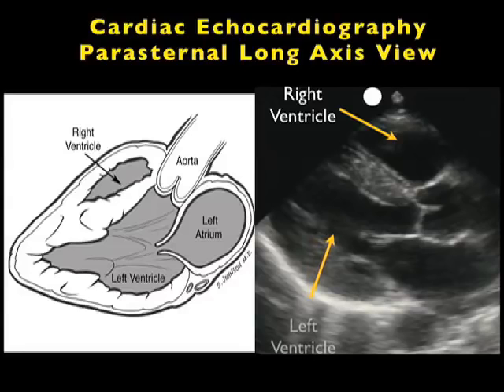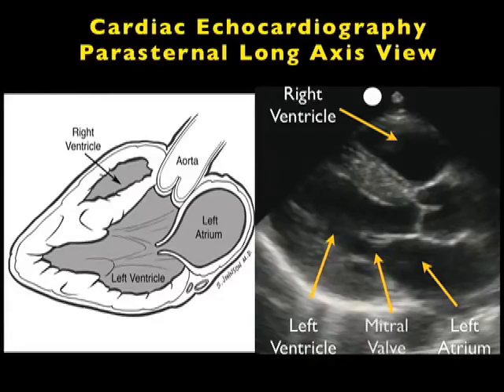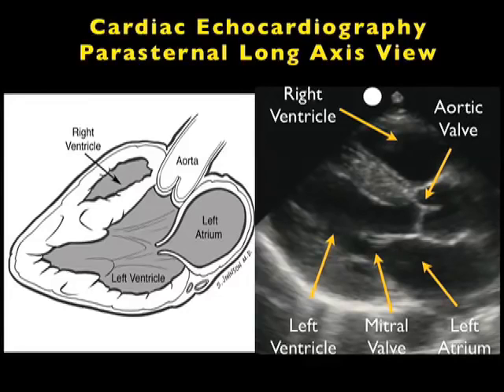Let's look at the ultrasound still image here to the right. Again we see the superficial right ventricle. Posterior we see the left ventricle with its more muscular and hypertrophic walls. Notice the left atrium is seen to the right of the left ventricle and the mitral valve in between the two chambers — we categorize this as left ventricular inflow tract. Note the aortic valve sitting right above the left atrium, and we see a little bit of the aortic root there. This is what we categorize as aortic outflow tract.